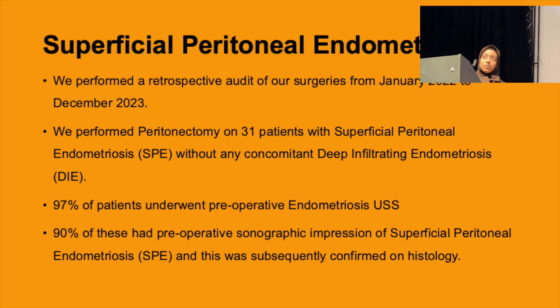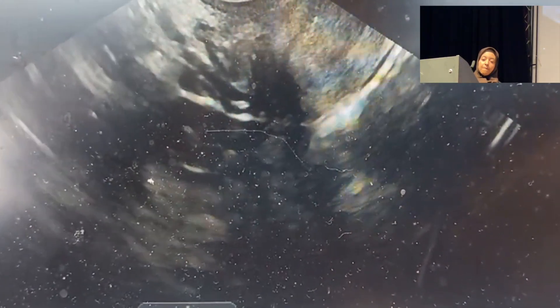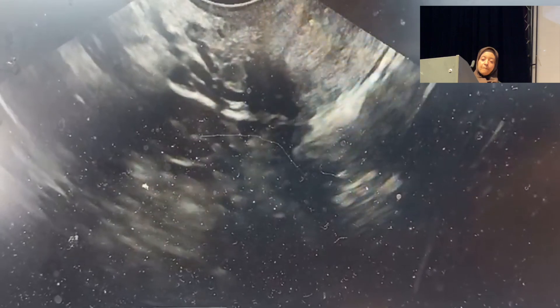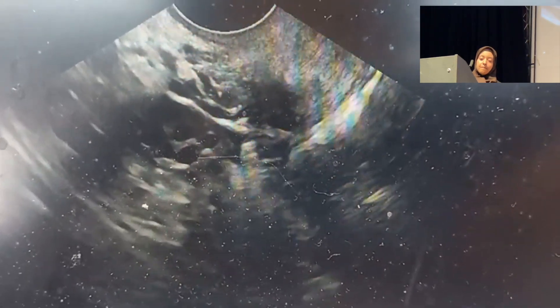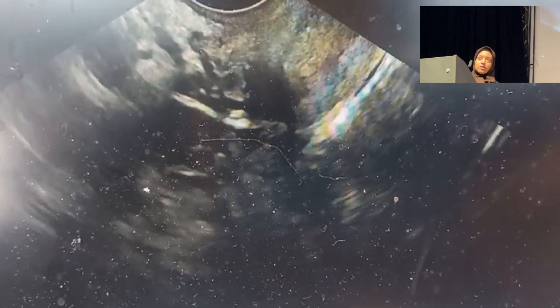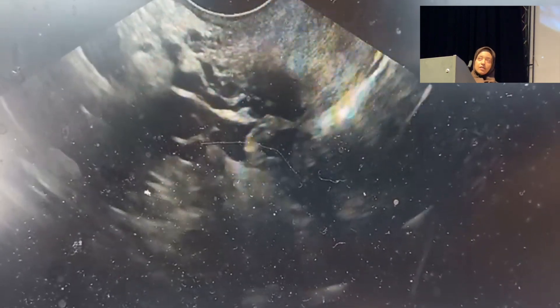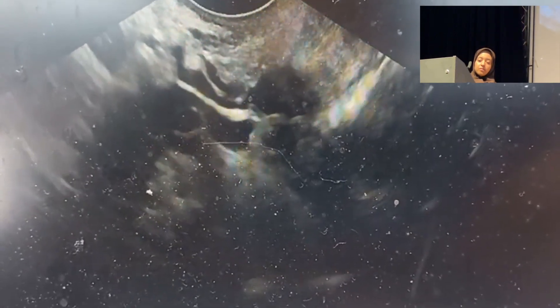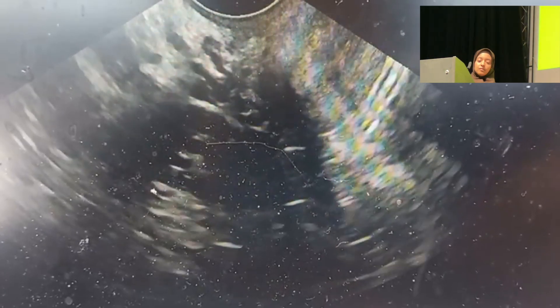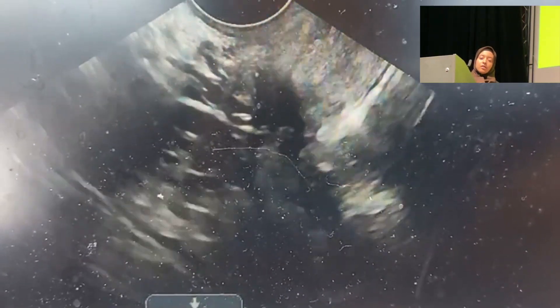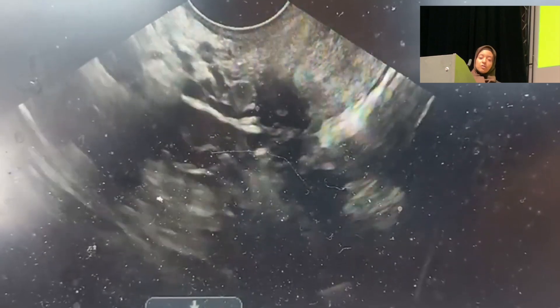Here I show an example of a negative sliding sign. We can see the right ovary is adherent to the right pelvic side wall, suggestive of superficial peritoneal endometriosis. The ovary is not freely sliding, so this is a negative sliding sign.